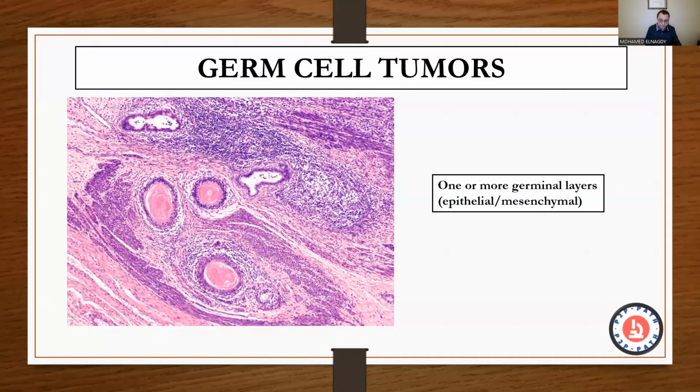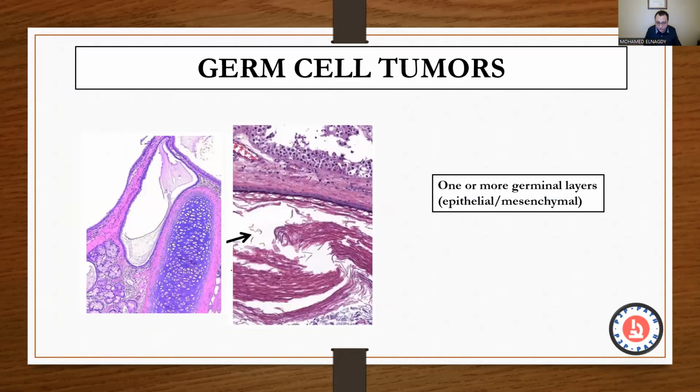What's that? Well, you know what? I see some epithelium there, and I see something which is really pink inside, which could be, I don't know, keratin, or is it hyaline? Can you go high power? Well, here is the high power here.